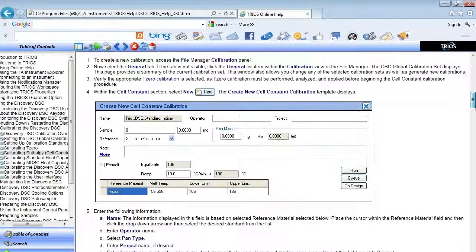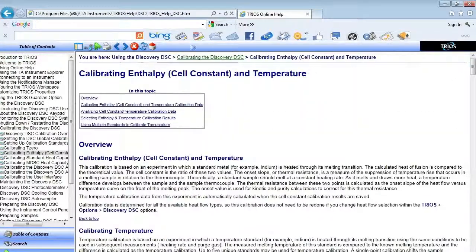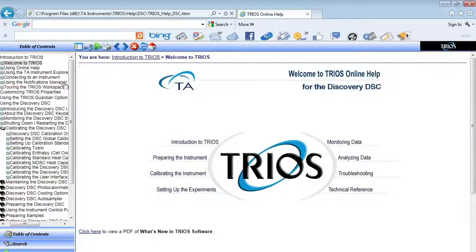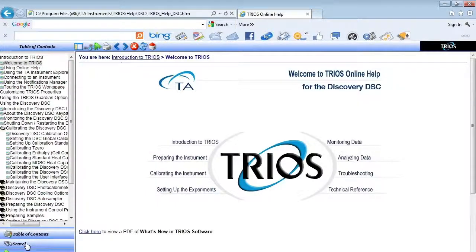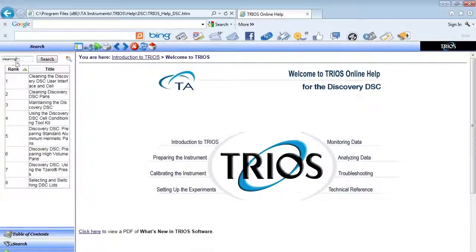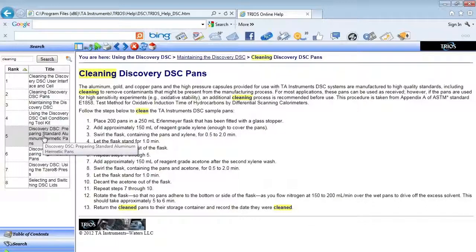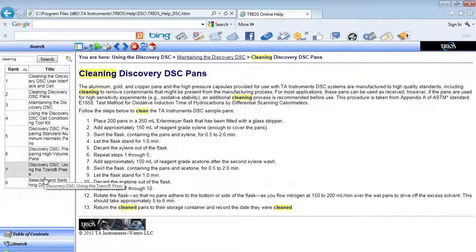You may also perform keyword searches for various help topics. Here, I have performed a keyword search for cleaning. Links regarding cleaning the DSC pans, cell, and auto sampler lid are brought up.